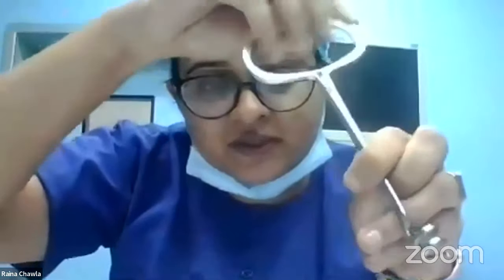If we're trying to remove the fibroid, we basically insert the screw into the fibroid after we give the incision. During a myomectomy, we give the incision over the serosa or the pseudocapsule of the fibroid. We locate the correct plane of the fibroid, then introduce this and use traction, especially for large fibroids. With this we get good traction of the fibroid, and then we can dissect the remaining fibroid from the pseudocapsule and take it out. So this is called a myoma screw. It is a very useful instrument used in myomectomies.